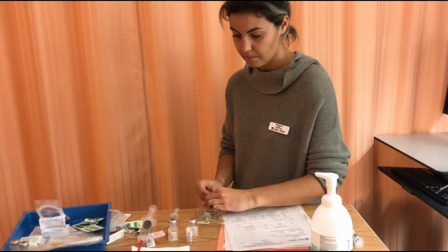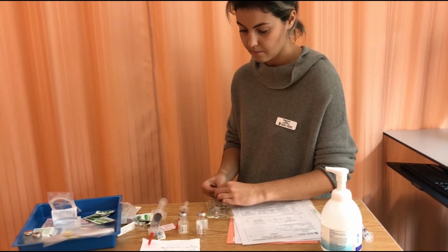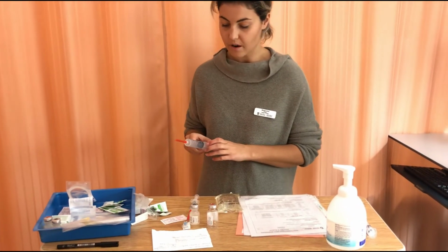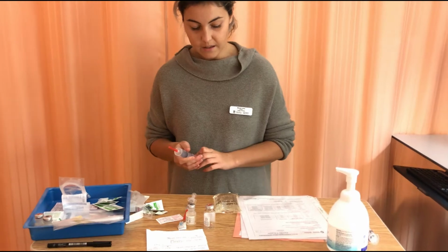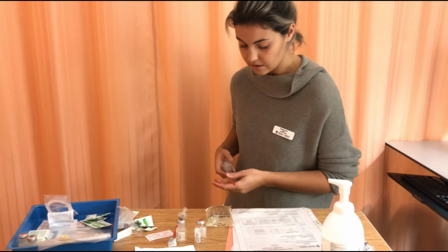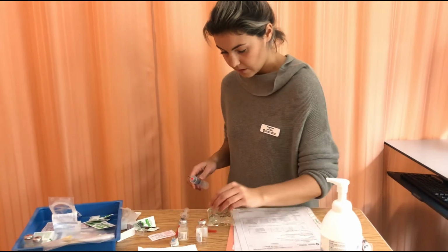So to begin with, I'm going to reconstitute this medication. According to my monograph, swab for 30 seconds again, and then let dry for 15. I'm letting the IV bag hang off the edge there, so I know that it maintains the sterility and the integrity isn't compromised at all either.